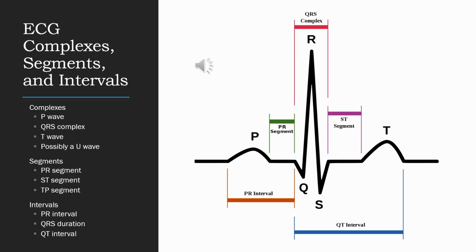So a couple of key takeaways from this slide here. We always want to correlate the ECG components with the patient's clinical presentation. Changes in waveforms, intervals, or segments can indicate things like ischemia, an electrolyte imbalance, conduction disorders, or even a life-threatening dysrhythmia. So if an ECG tracing appears irregular, we always want to assess the patient first. Don't rely solely on the monitor.